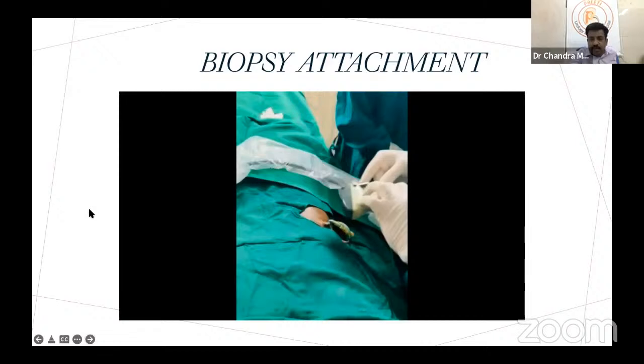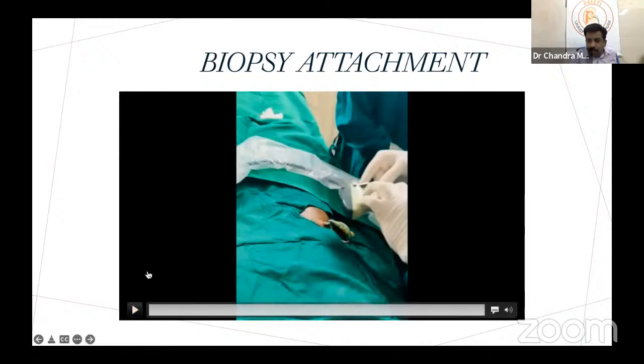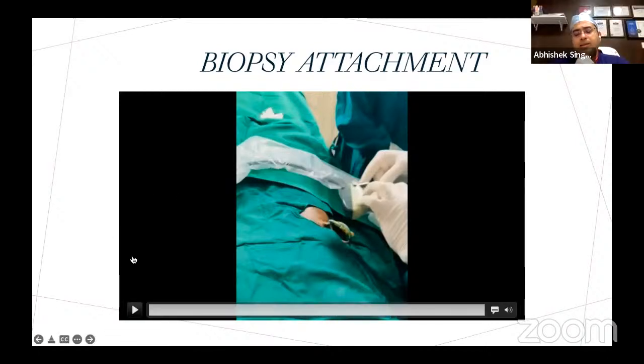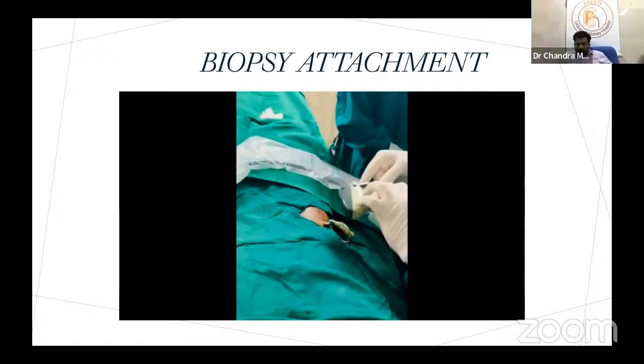Respiratory movements make a little difference here. You should get back to that position where you have aligned the trajectory, isn't it? Yes, sir, that is important. It is also a function of how much dilatation of the kidney there is. If the dilatation is minimal, then you require a deeper plane of anesthesia. When there is more than 10 mm of dilatation, 1 or 2 millimeters will be forgiving. But the puncture movement has to be done within a fraction of a few seconds, until the point the patient can hold his respiration in a particular way.